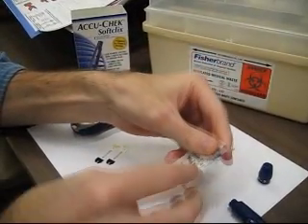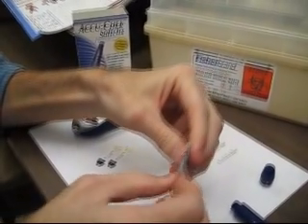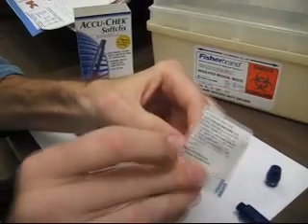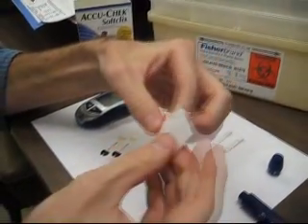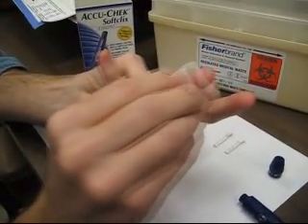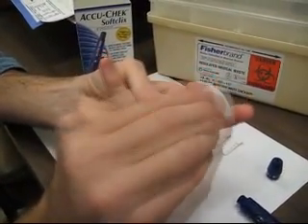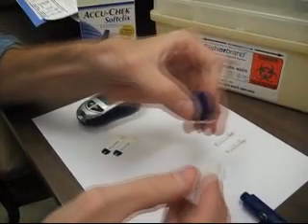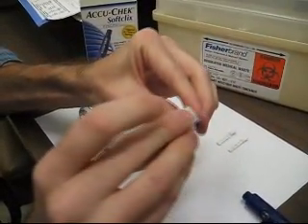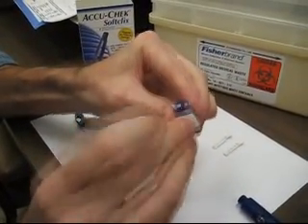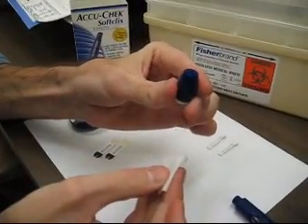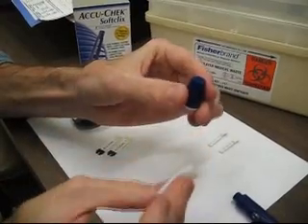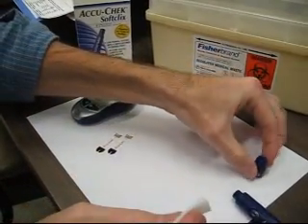Make sure to clean off your fingertip with an alcohol wipe. Your finger will need to dry before you actually lance it. Clean off the cap of the lancet device with the alcohol wipe as well.